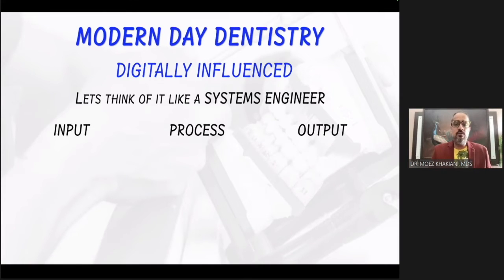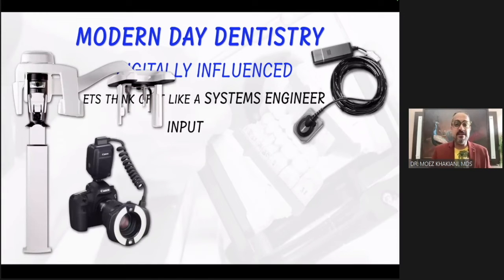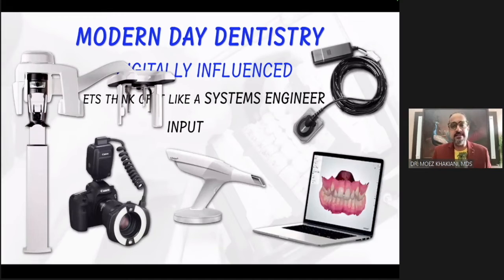So what is the input with respect to dentistry that is digitally influenced? Think about it. It's a part of every practice, I guarantee to you. Why? Because we all have this. With our inputs, we have RVGs, we have OPGs. These are all digital. We have digital cameras with us. And of course, today, something that is at the grassroots level of every digitally modified practice, it's the presence of an intraoral scanner. If you're looking at your mobile phone, that mobile phone is also digital, which means you are digitally influenced if you're taking mobile phone pictures.